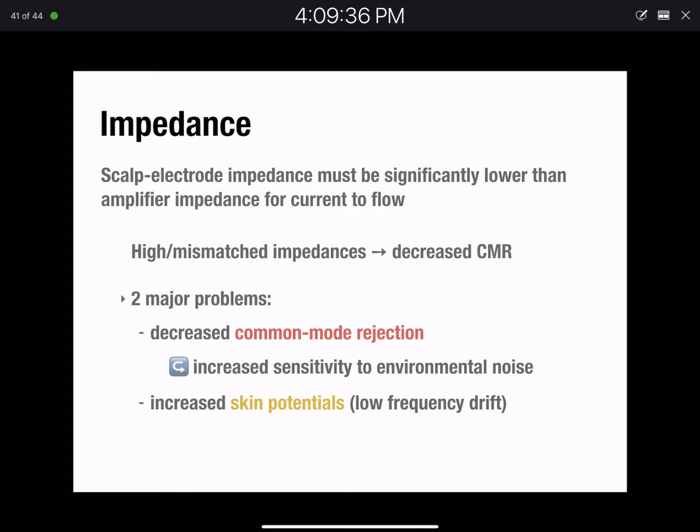And so that's actually a good hallmark. Once you've got your data from a subject, you average your trials together, look at it. If it looks like these nice big, smooth, slowly changing potentials across the scalp, that's pretty good data. If it looks like you've got a lot of really fine-grained stuff going on, that's probably because you've got a lot of noise and maybe mismatched impedances at different electrodes. And so you don't get that nice, smooth representation of the brain activity. All right.